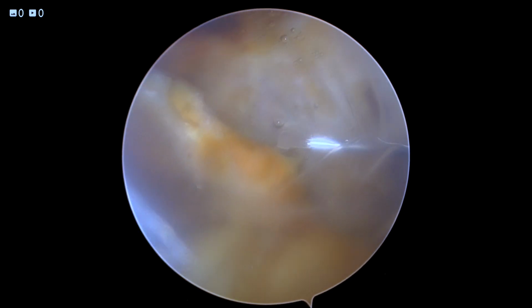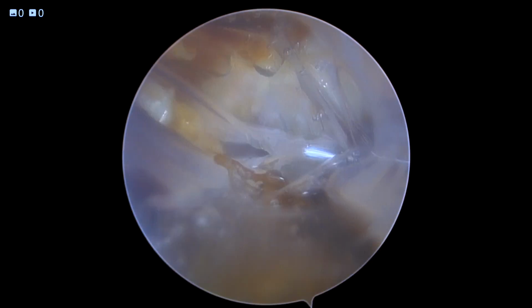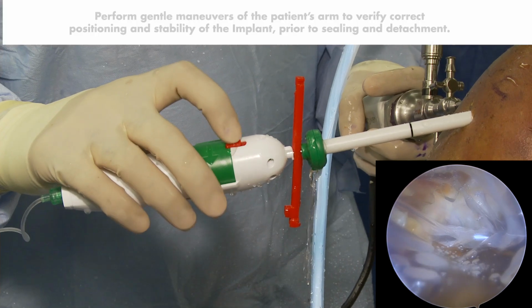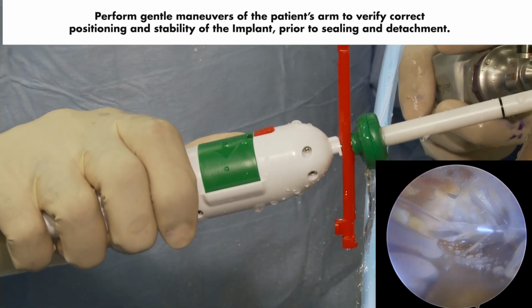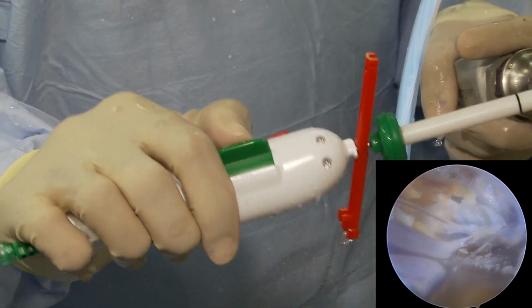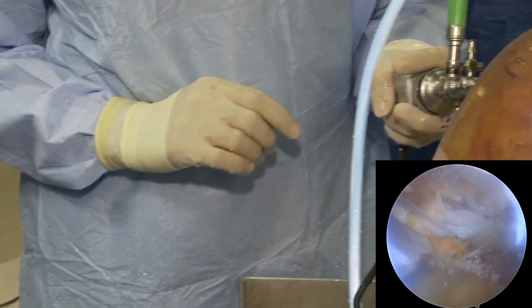Okay, so now once you have the implant appropriately inflated within the subacromial space, you can see that we've clearly visualized the inflation here on the arthroscopic view, as well as checked to make sure that we've inflated to the appropriate volume. We're now ready to actually deploy the implant. To do that, we press this red button in order to free up the insertion knob, and then we simply slide the insertion knob all the way until we feel a click. That will seal and release the balloon, allowing us to remove the insertion handle, leaving the balloon in place.